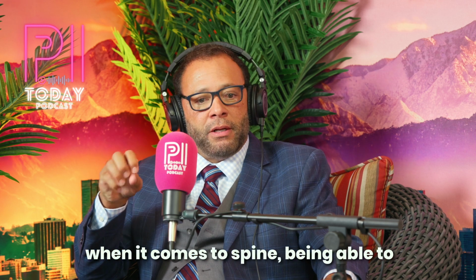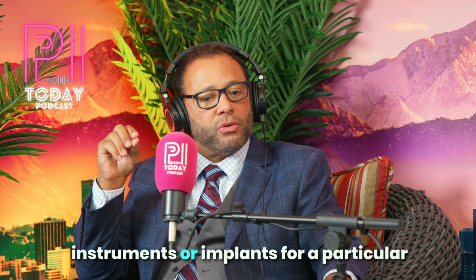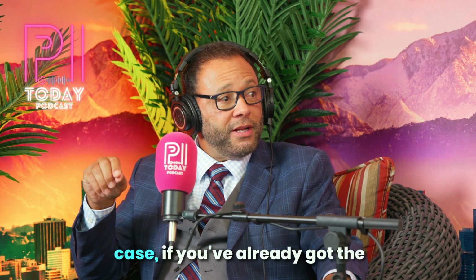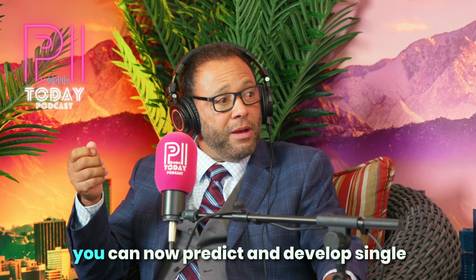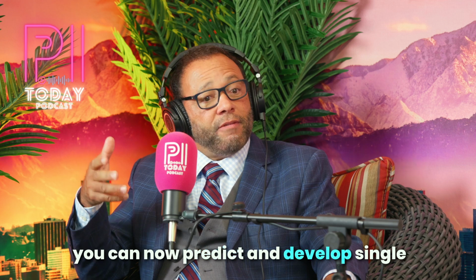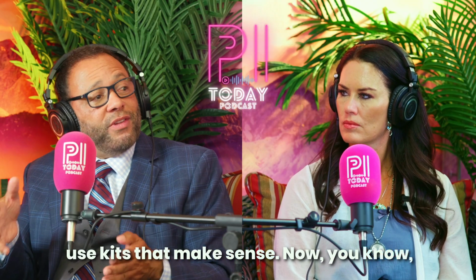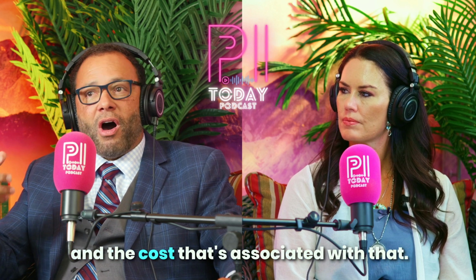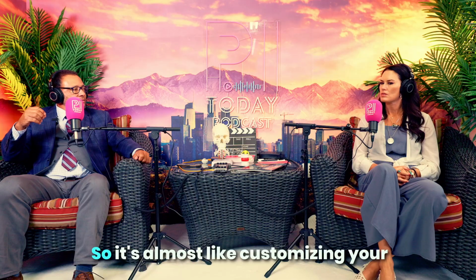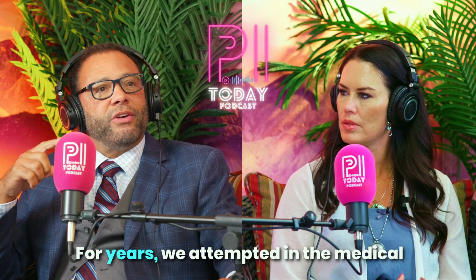So when it comes to spine, being able to predict the actual necessary tools, instruments or implants for a particular case, if you've already got the measurements, kyphotic and lordotic angles, trajectory, screw lengths, diameters, you can now predict and develop single-use kits that make sense. Now you know this is exactly what you need, so you don't have to have 50 trays in the room and the cost that's associated with that. So it's almost like customizing your treatment.